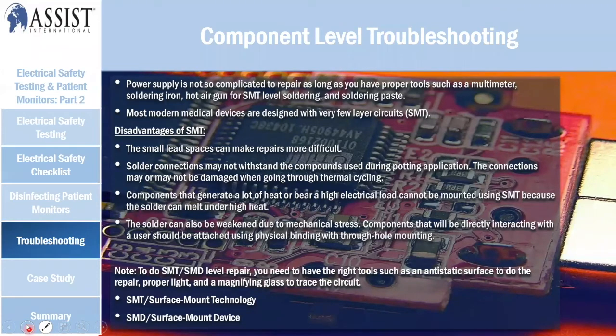Some people did ask about component level troubleshooting on medical devices. Yes, you can do certain testing, but you have to know that most medical equipment nowadays uses SMD, SMT level circuits. That means the circuit becomes very small. Repairing is more difficult because the component size becomes small. Soldering may not withstand certain temperatures, which can cause your multi-layer board to expand and lose connection. You can damage it because of the thermal cycle.